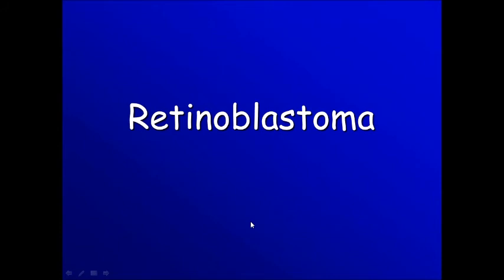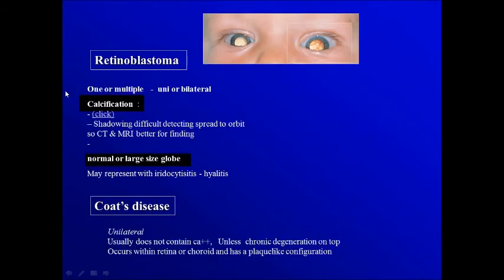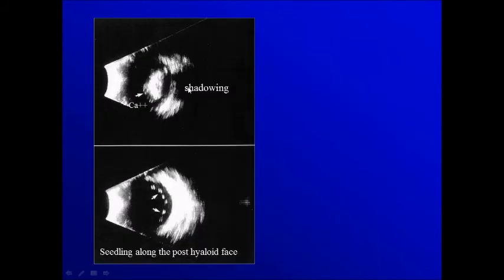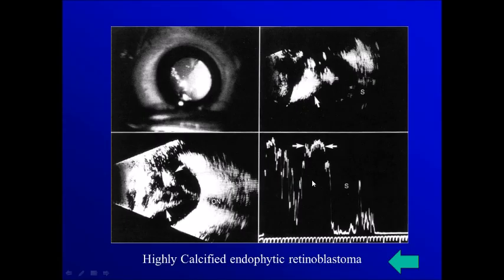Turning to retinoblastoma — it can be unilateral or bilateral and can be single-focus or multifocal. It is characterized by calcification, which can produce shadowing. Sometimes we can see seedlings of the tumor along the posterior hyaloid face. You can see here high reflectivity due to calcification, and on the A-scan, very high spikes.